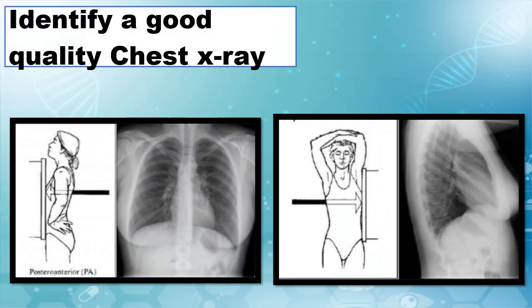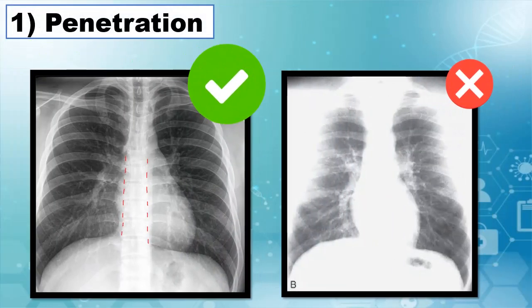When we analyze the technical quality of a chest x-ray, we will have to take a look at four major points. The first of them is penetration — this means how potent our x-rays are. A film taken with too much penetration will highlight dense structures but won't allow us to look at finer structures, and a light penetration won't even trespass the chest wall effectively. In order to check our penetration, we will check if you can see the outline of the vertebrae behind the heart. If you can see them, we are okay.